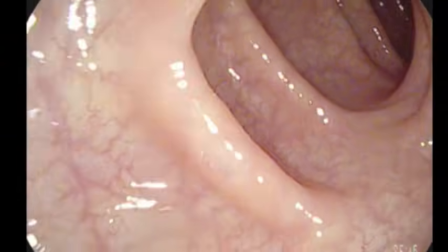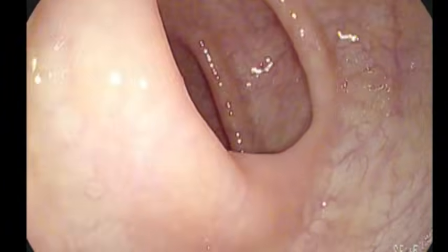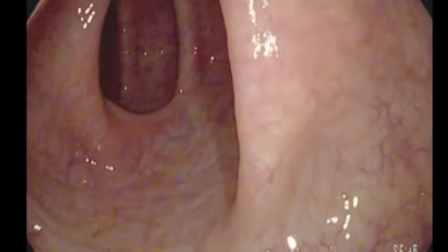The colonic mucosa, as seen throughout this procedure, is almost completely translucent, showing a clear view of the vascular plexus. As the scope progresses towards the rectum, also notice the disappearance of the repeating pattern of pouches and folds, and the relative increase in vasculature. The pit pattern can also be clearly seen.